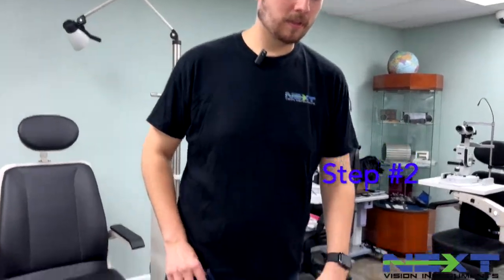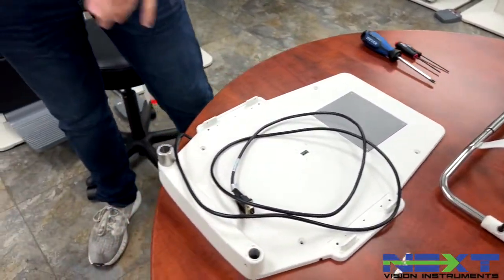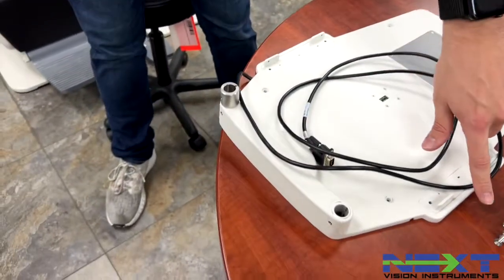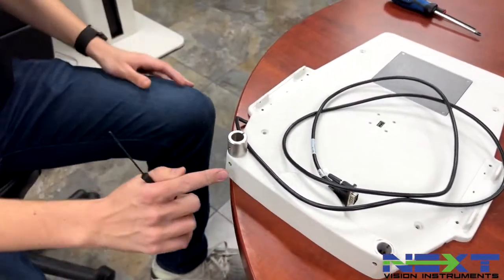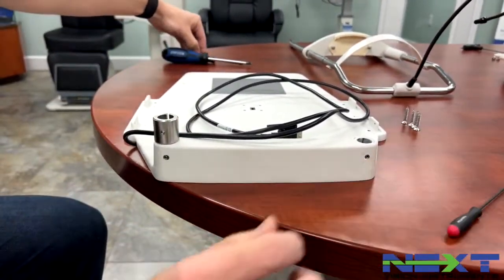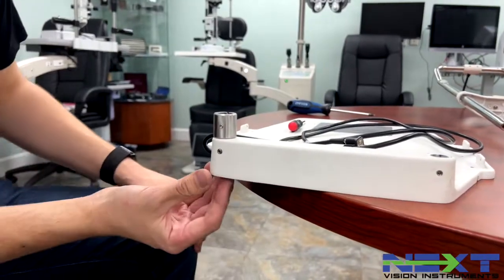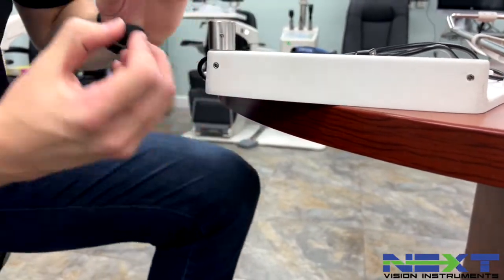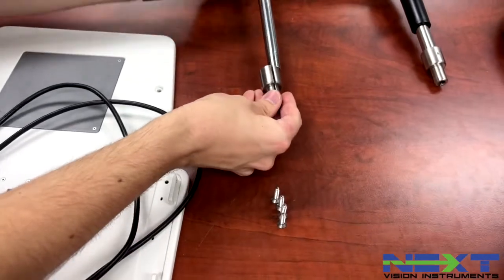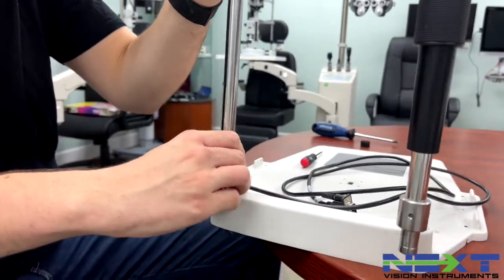Step two is installing the base plate and the headrest. For this part you'll need your Phillips head, your two-and-a-half millimeter, and your two millimeter allen wrench, as well as four screws. Come over to the back side of the base plate and use your two millimeter to back out a screw, then your two-and-a-half to back out another slightly, so you can remove that piece. Under there is a foam piece you need to take out. Pop that out, grab your headrest, run the wire in the channel, and pull it through the hole.